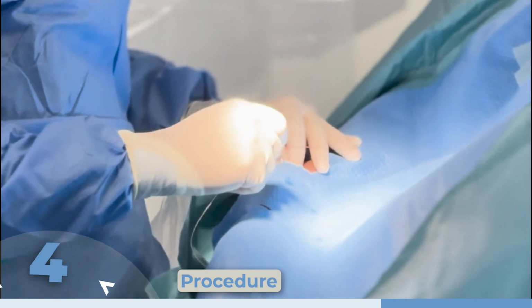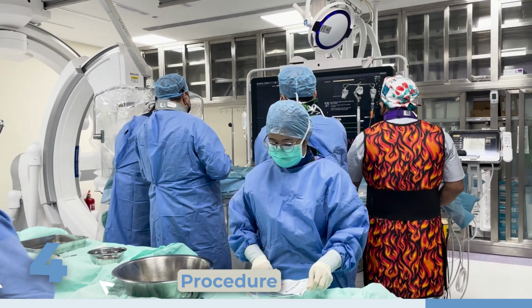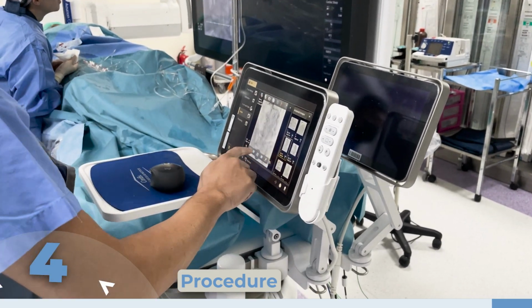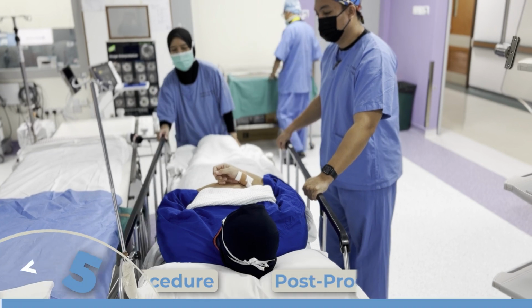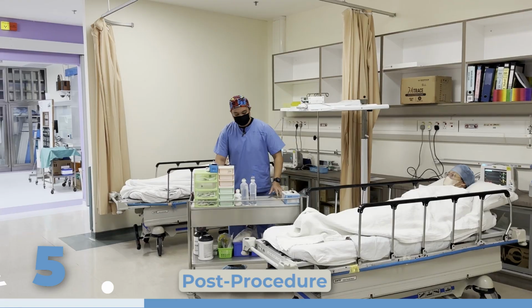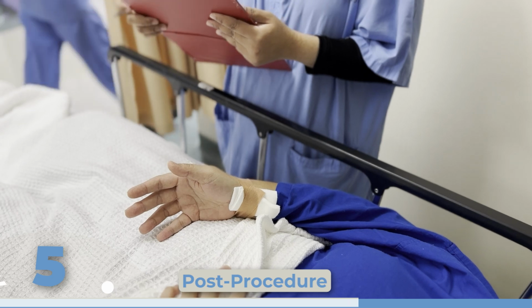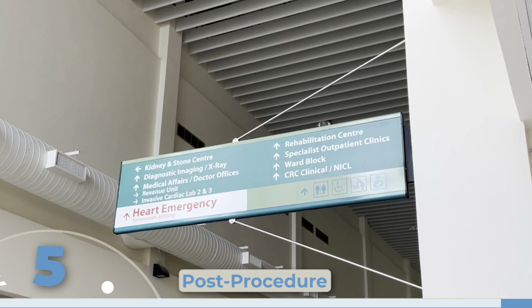Before performing any interventions, the cardiologists review the diagnostic images provided by the radiographer. These images give them a clear understanding of the patient's heart blood vessels and guide their decision-making during the procedure. After the angiogram is completed, the patient is placed back in the recovery bay for monitoring. This allows healthcare professionals to observe the patient's condition and ensure their stability before transferring them back to their respective department, such as the ward or daycare unit.